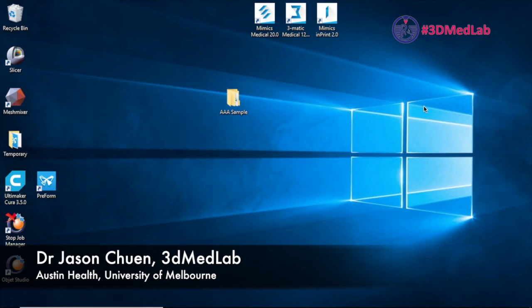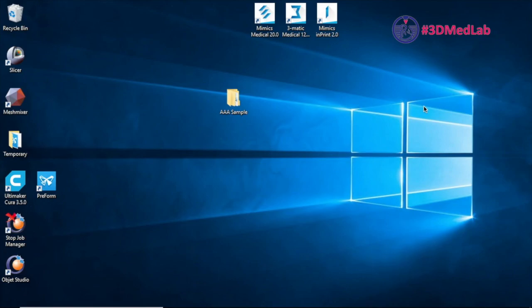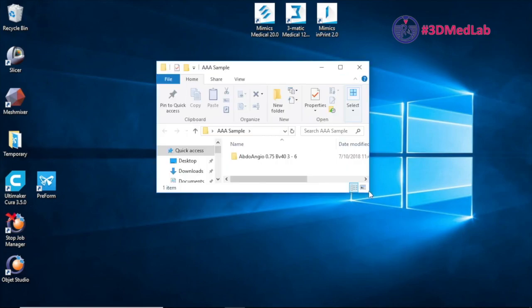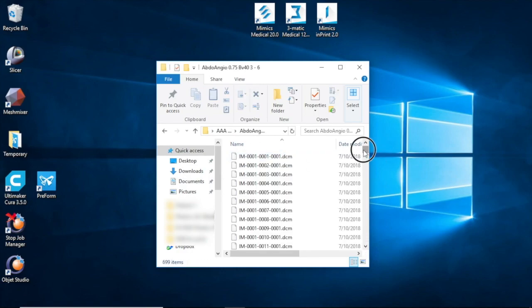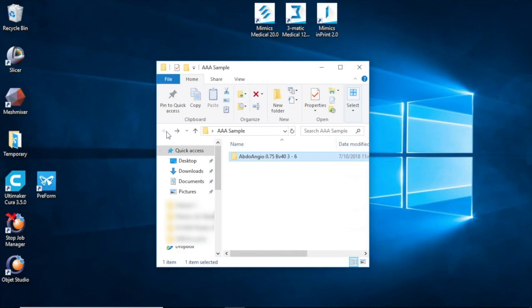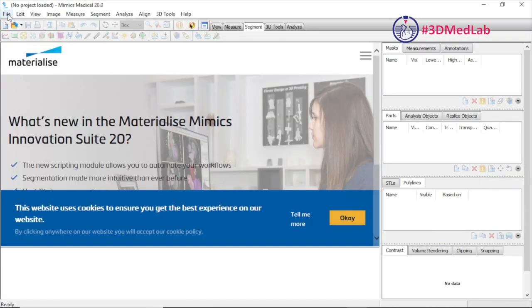Welcome to our Mimics walkthrough. We're going to segment an abdominal aortic aneurysm today from a contrast CT scan. We've got our anonymized AAA DICOM dataset here on the desktop and you'll see all our DCM files listed here. This is going to be our working folder where we will store our files. We'll go ahead and open up our Mimics Materialise Innovation Suite — this is the medical version.